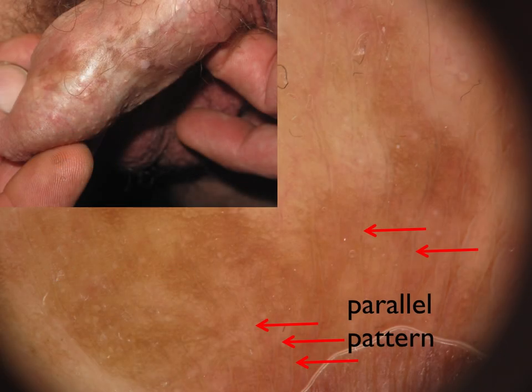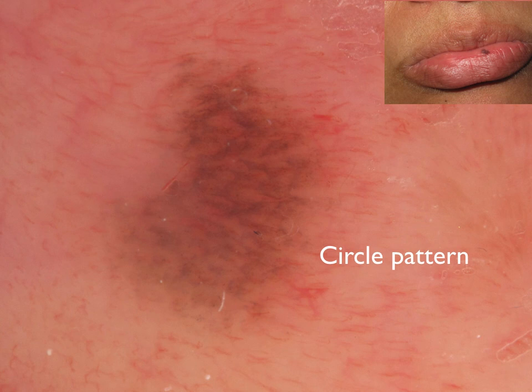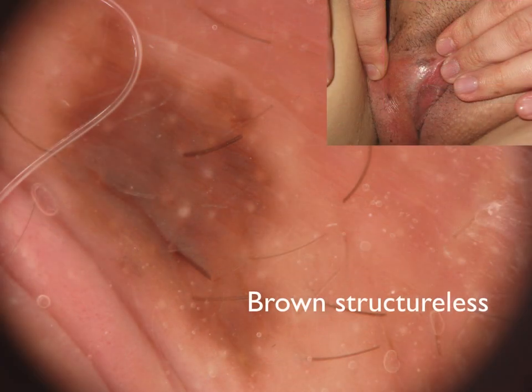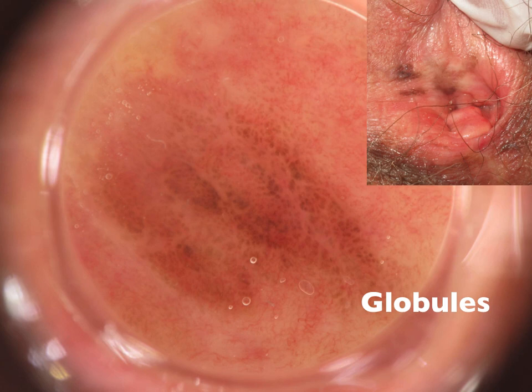The parallel pattern is mainly seen on the penile shaft and is composed of linear or curved lines. The circular pattern is mainly observed on the lips. The structureless pattern shows diffuse homogeneous brown pigmentation with no additional dermoscopic criteria. On the labia majora, orifices of glands and hairs are spared, and the aspect is similar to the pseudo-network of solar lentigo on the face. The globular-like pattern is similar to globules of melanocytic lesions.